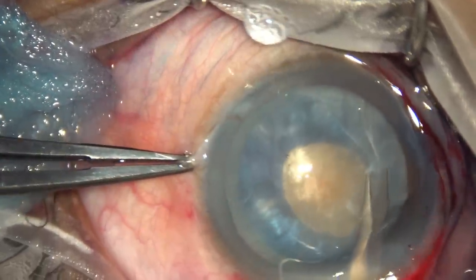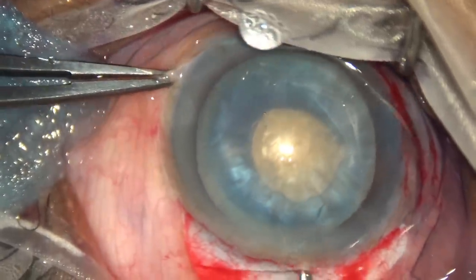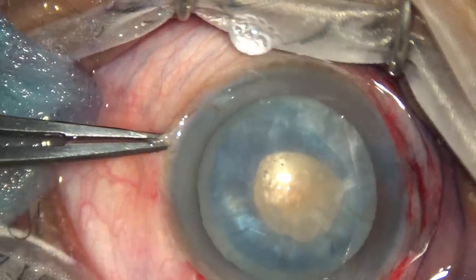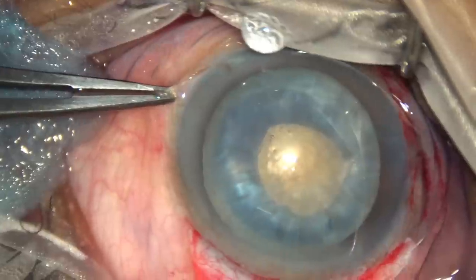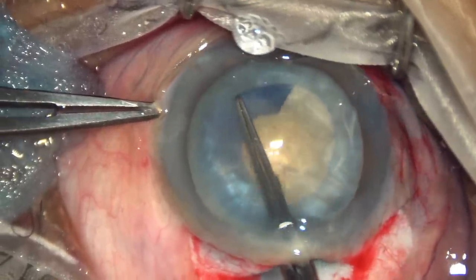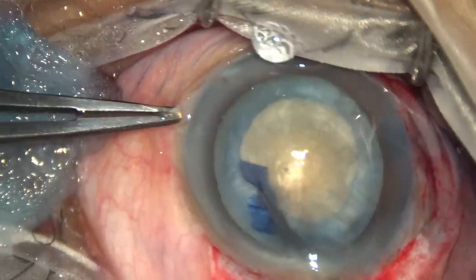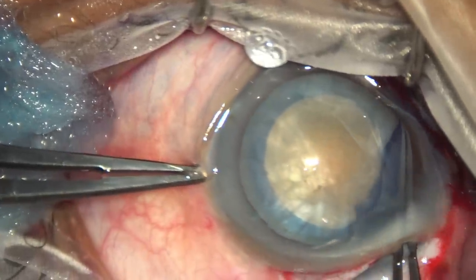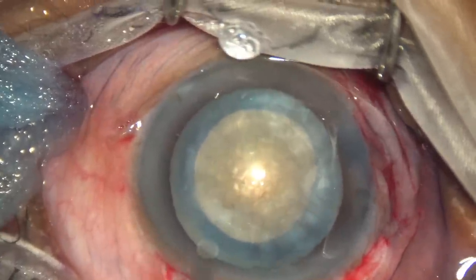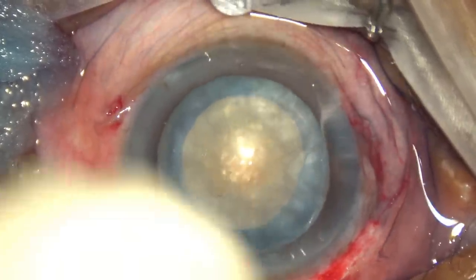Take a Vannas scissor, make a cut. Now fold this flap and do adequate size cuts. Get up in the tunnel and open.